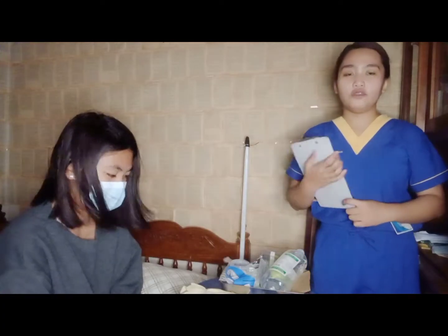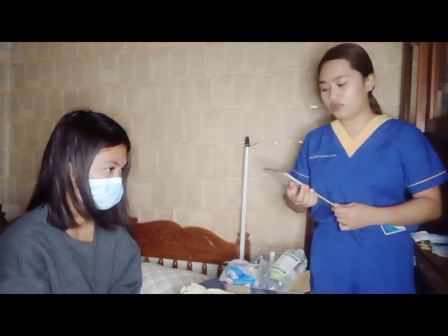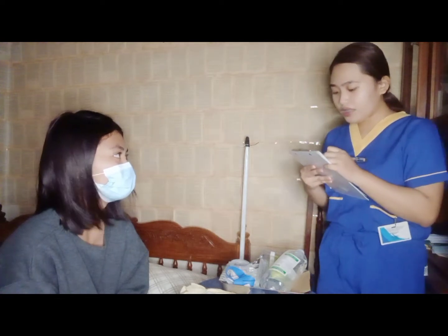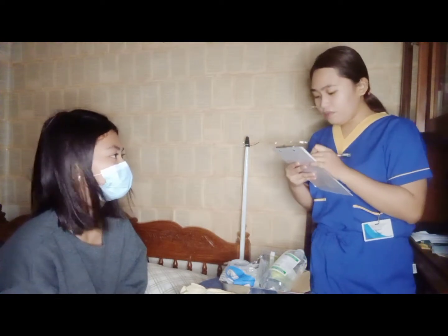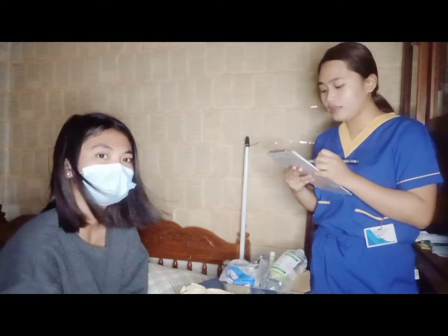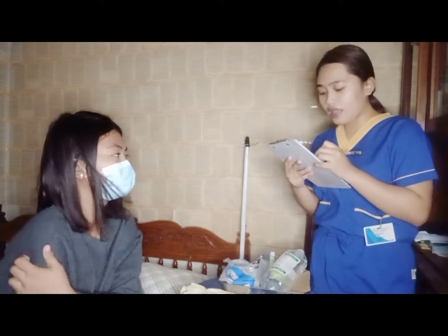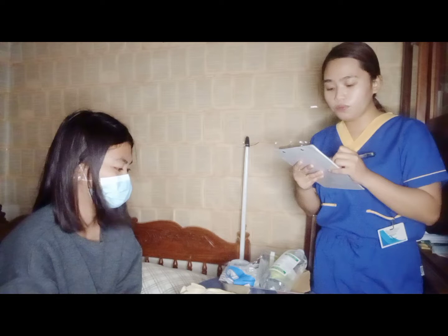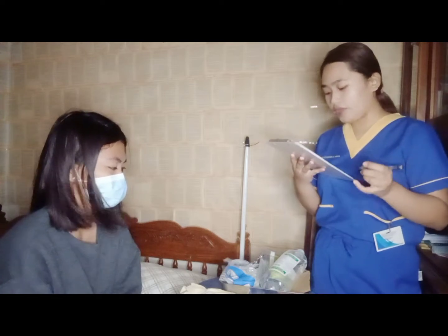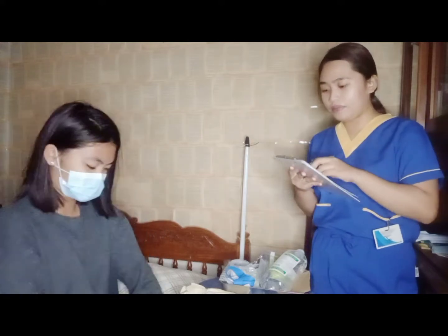First, we will check for the doctor's order for the administration. This is to ensure safe and accurate IV administration. So, let's check the patient's chart. Private room 3, patient Stephanie Sarafica, 18 years old, birth date September 22, 2003. The diagnosis is risk for electrolyte imbalance, hyponatremia related to diarrhea. The doctor's order is to start an IVF, 1,000 ml of sodium chloride 0.9% at 100 ml per hour. The purpose of administration is fluid and electrolyte replacement.